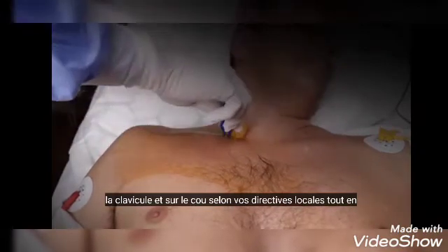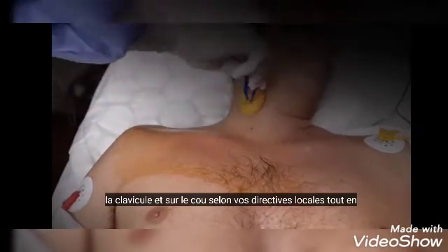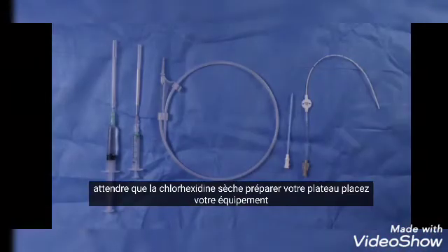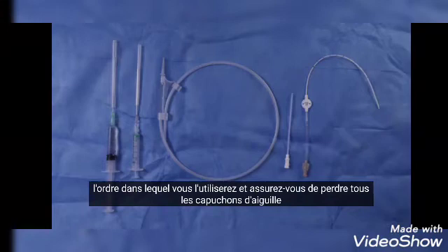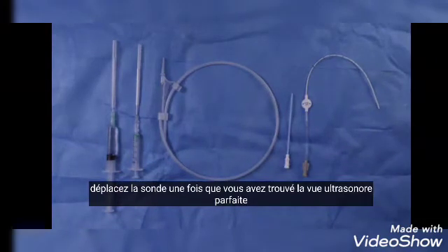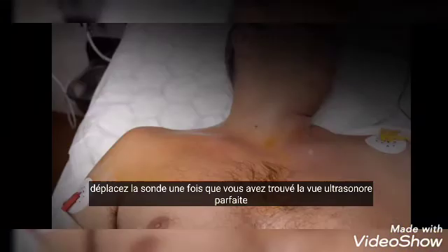Prep a large area including the clavicle and up on the neck according to your local guidelines. While waiting for the chlorhexidine to dry, prep your tray, place your equipment in the order you'll be using it, and make sure to loosen all needle covers. Everything should be easily accessible by one hand.